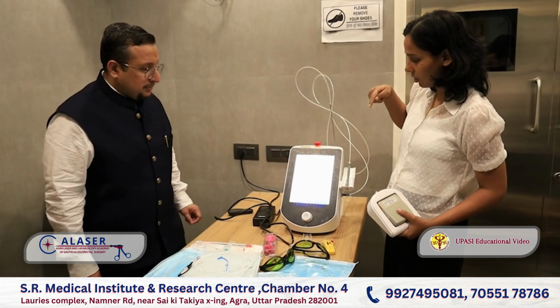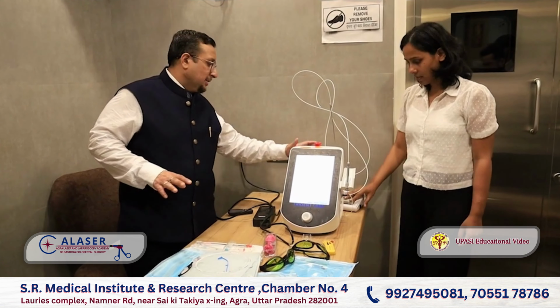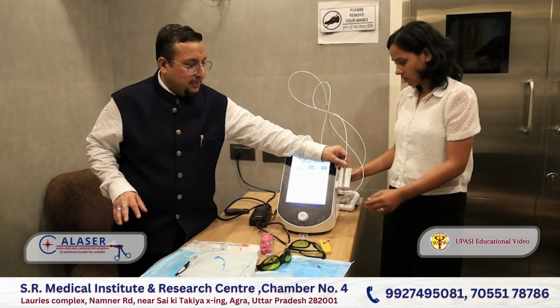Yes. And because this is a dual model, you can select your wavelength from here. If you want to work on 1470, or if you want to work on 980, or you want to work on the combination where simultaneously you can deliver 1470 as well as 980. Yes. So this is a dual wavelength. This is about the machine. Yes. There's a connection. Now we will go on to the fiber part, right?